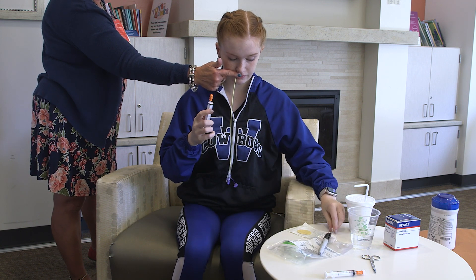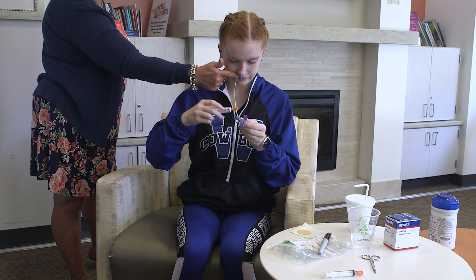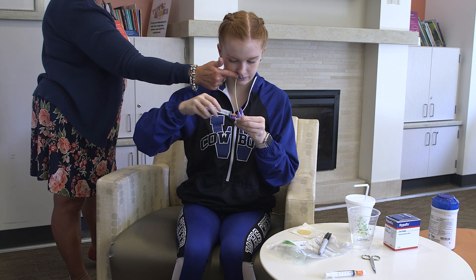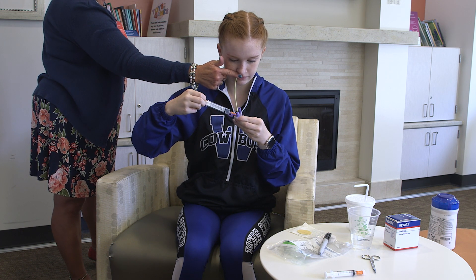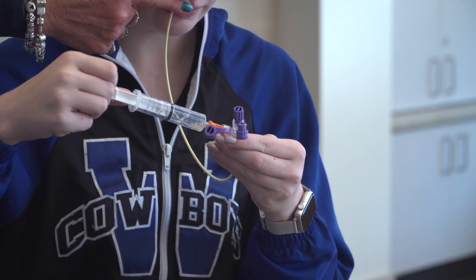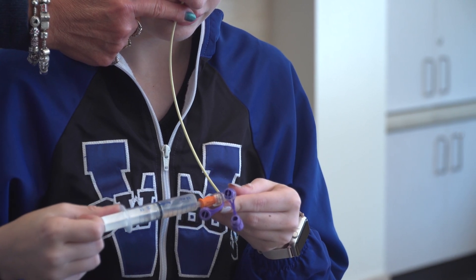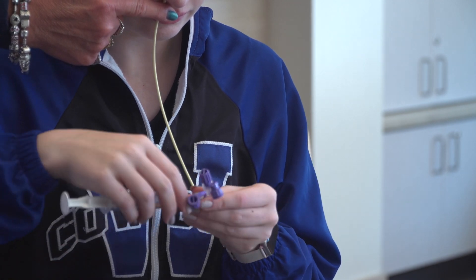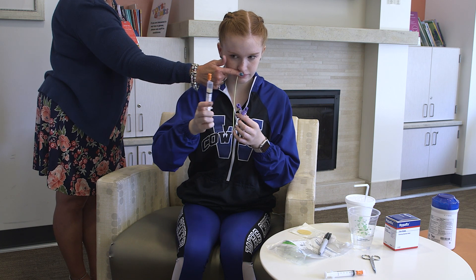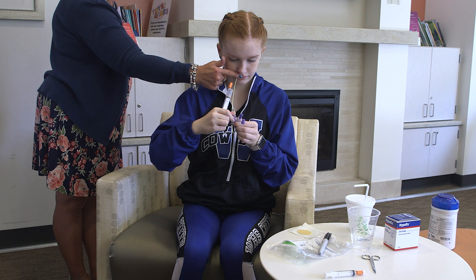Attach the 5 ml syringe to the end of the feeding tube and pull back on the syringe to obtain gastric contents. A small amount of gastric contents is needed to confirm placement and is usually cloudy or green, tan, or off-white in color. Throw away the gastric contents — do not refeed. The tube placement must be confirmed before starting any feeding.